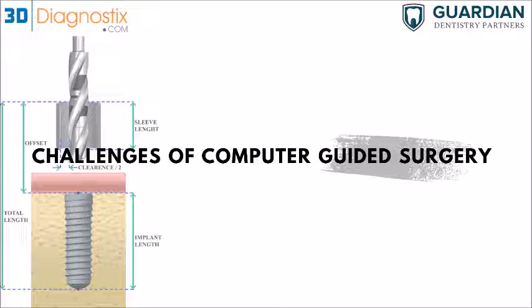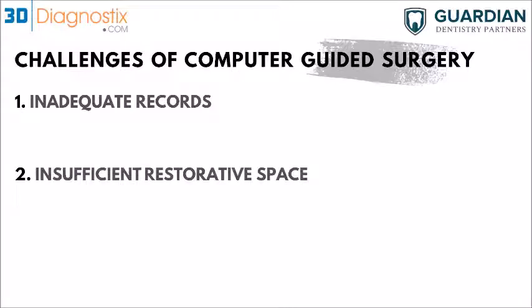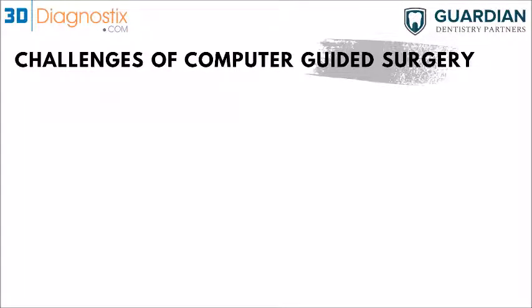Okay. So what are these challenges we usually see with computer-guided surgery? We're going to be starting with inadequate records, so records that are incomplete, and insufficient restorative space. I think we've mentioned them before, but we're going to be talking about that in more detail right now, and then possible discrepancies. So these are the challenges with computer-guided surgery in general.